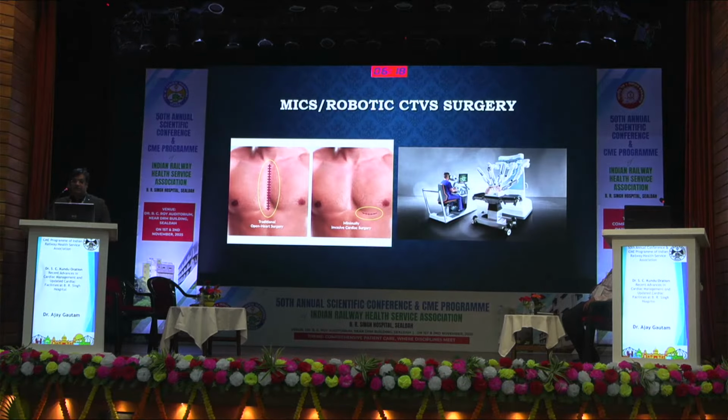This is MICS. The classical incision was a very long central incision. With MICS surgery now, the scar is very minimal and it is very effective, and early mobilization is possible. In our setup, we discharge the patient as early as possible, so manpower loss, man-days loss will be less and less. On the right side, you can see robotic surgery, and it has come up in India also, and even the operator can operate from a distant place. So this is the advantage of robotic surgery.